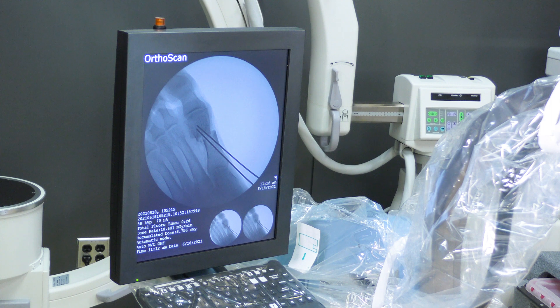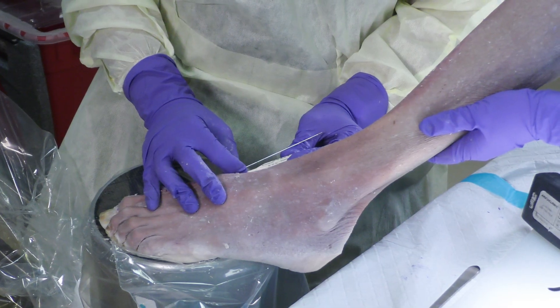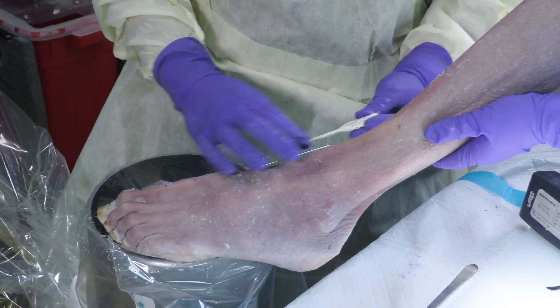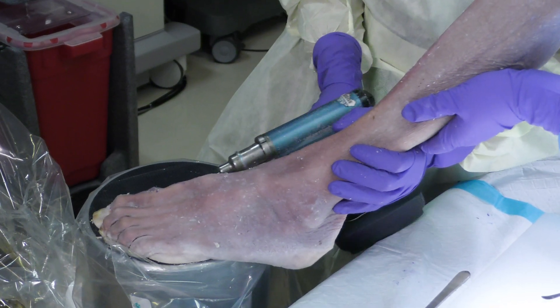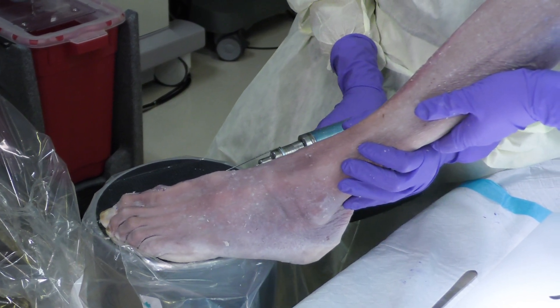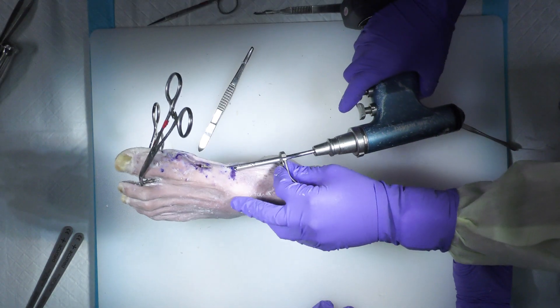I like to go a little shy of where I think I want to be because I want these screws to be buried. I'll measure the proximal screw first, getting all the way down to bone — we're going to do 34s times two. Now I will advance these wires so I don't lose my position, intentionally coming up out of the skin.